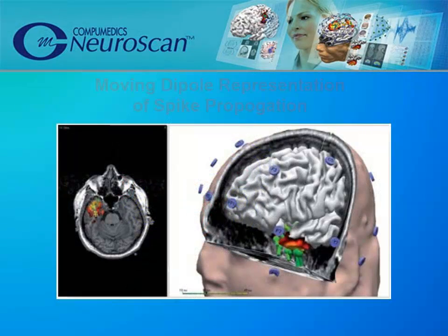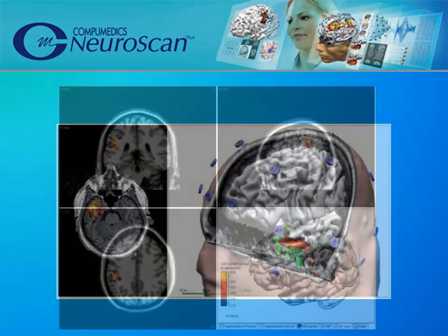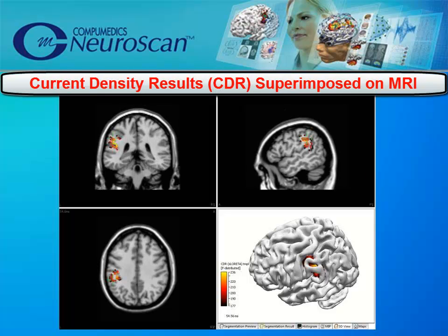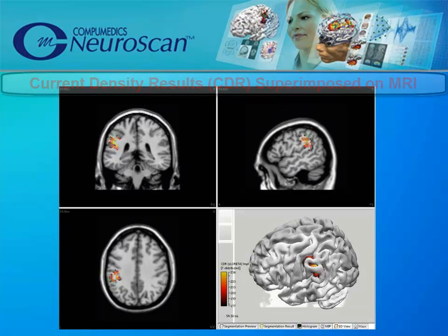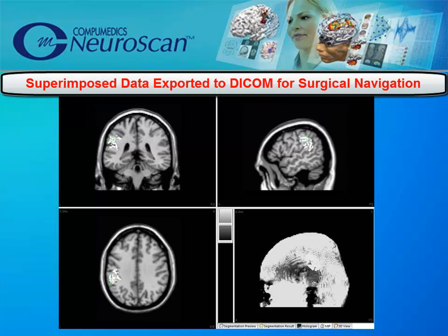Display capabilities in CURRY allow you to create final figures depicting selected results. In this example, a moving dipole representation of propagating spike activity is displayed in a cutaway view along with current density results. In another example, current density results are superimposed on the patient's MRI for precise localization of the activity. The source results can then be exported in DICOM and other formats for use with surgical navigation systems.